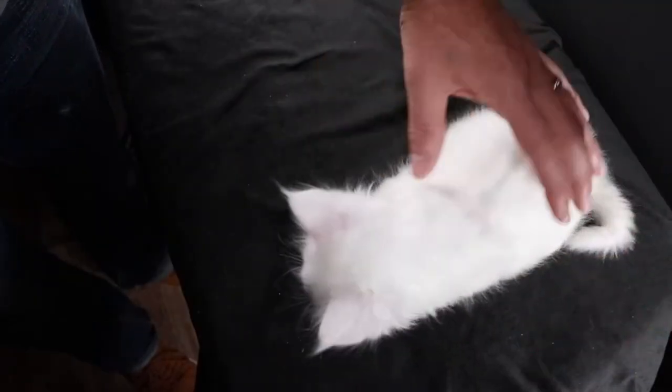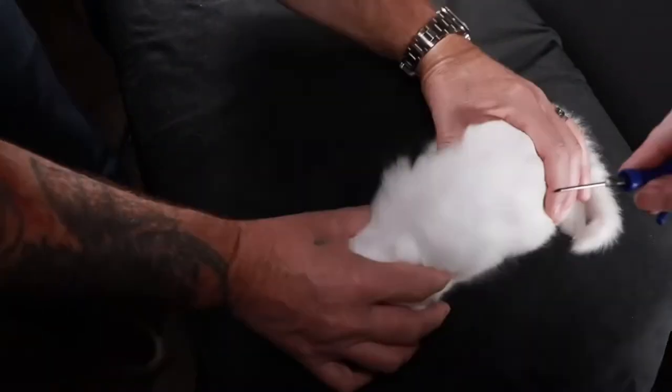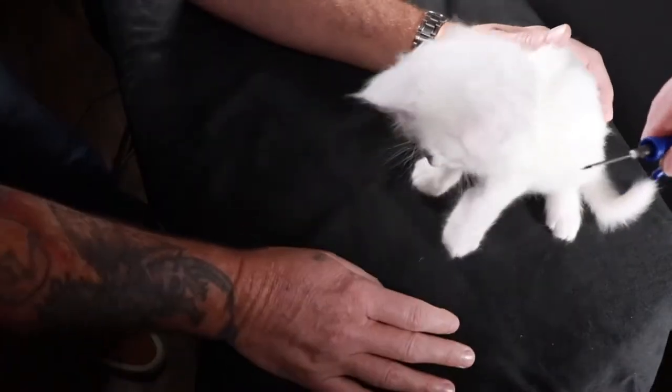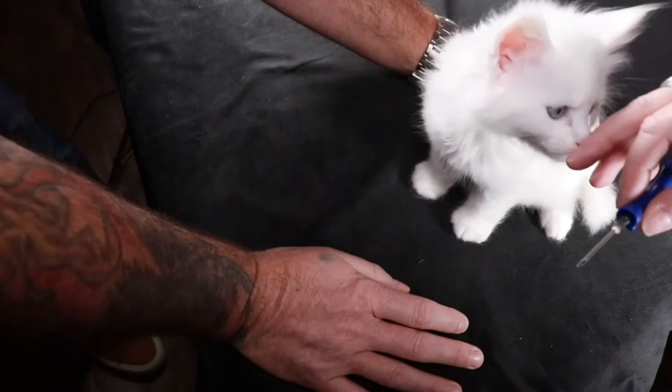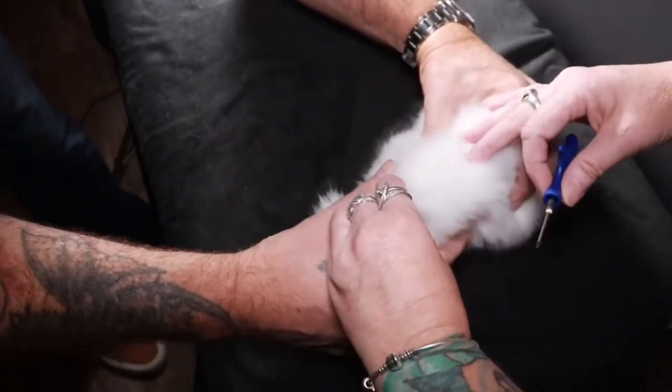With my helper, he's just going to hold the kitten right around the neck because he might squirm a little bit. I'm using the beveled edge up. I'm going to insert it with the beveled edge pointing up. I'm just going to make a tent with his skin.